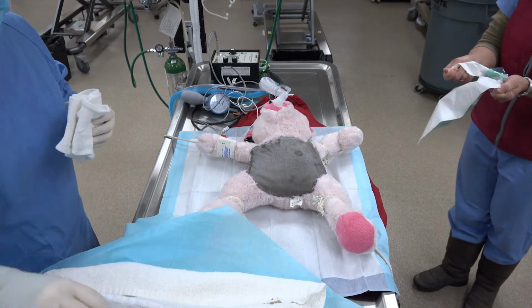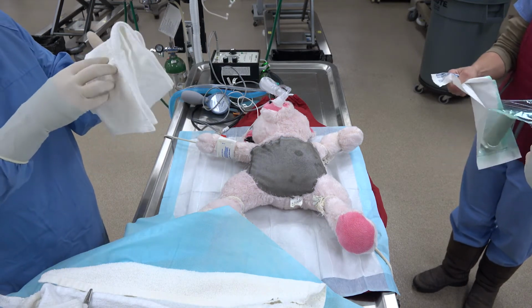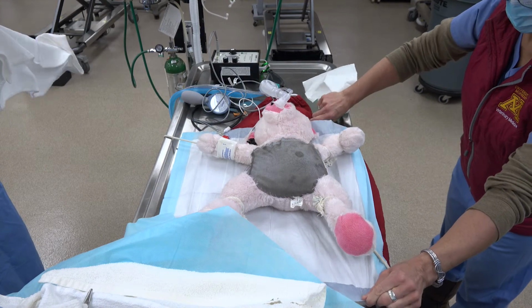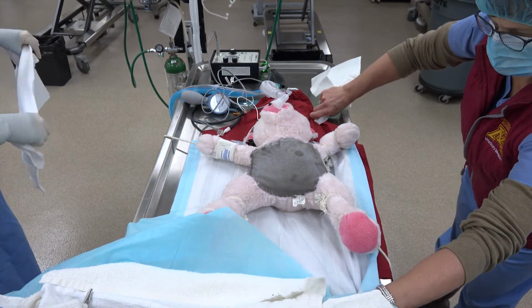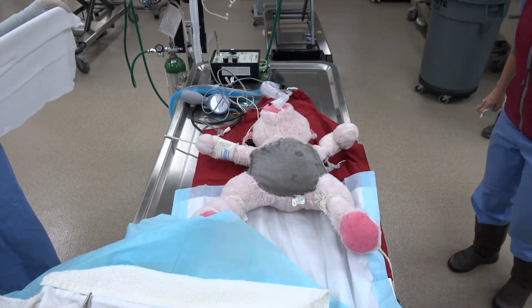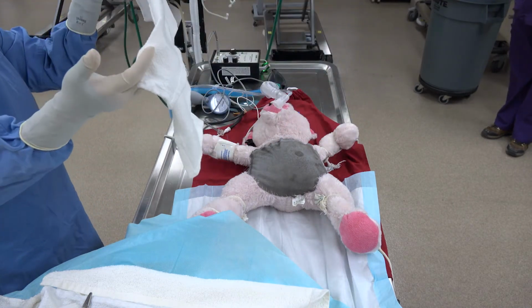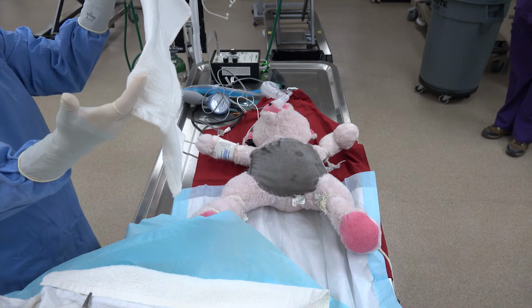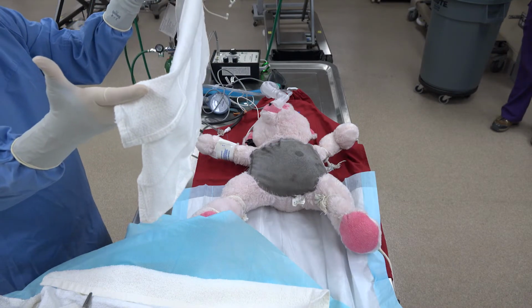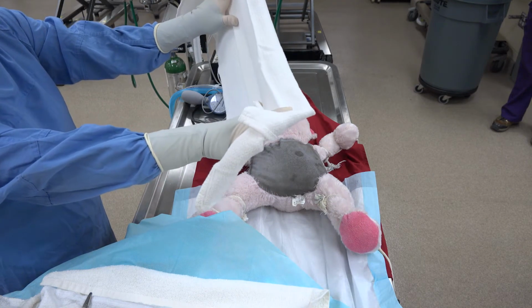All right, so now we have our towel clamps ready and we have our drape ready. So the first thing I'm going to do is when I open up my drape, I'm going to step a little bit away from the table so that I don't accidentally hit the table with any portion of my drape. Then I'm going to make sure that I have a little folded in portion that's going to go towards the animal, and this is an example of the folded in portion. Then I'm going to make sure that my hands are wrapped on the inside. So if you put the towel in between your index finger and your middle finger on both sides with your thumbs facing up like this, and then fold your hands in, it's protecting your hands from accidentally touching anything that is not sterile.